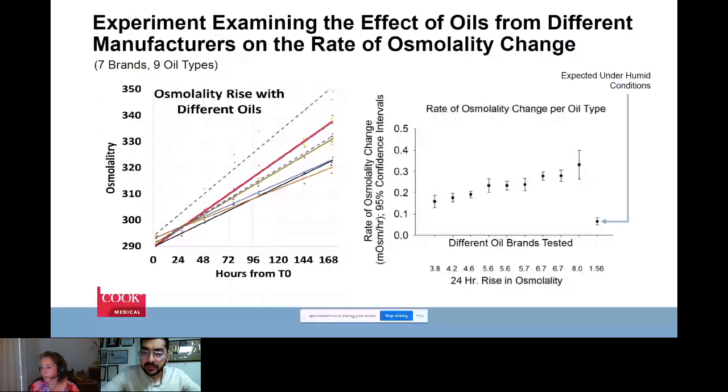No, it's not. And any best practice ways of equilibrating oil? From what I've tried to understand here, maybe pre-equilibrating doesn't really make that much of a difference if you're using it in a dry environment, and definitely not mixing media with it, because we've seen that that's when the oil becomes toxic really easily. I know that in the past, because I've done it myself, we used to wash oil with media. But we've actually seen that it can make the oil more toxic if that oil is one that has issues.